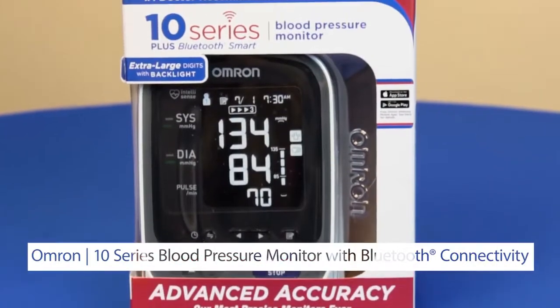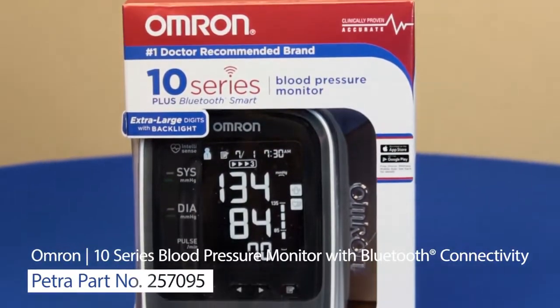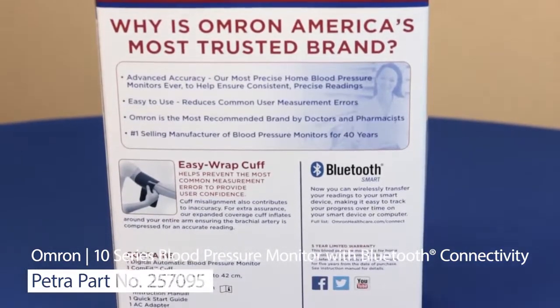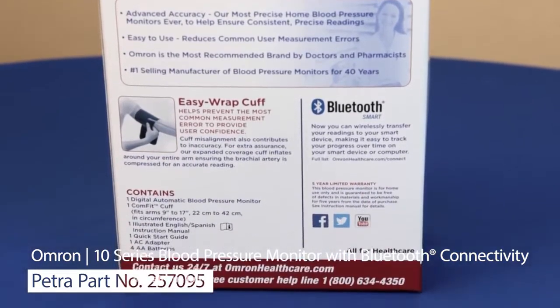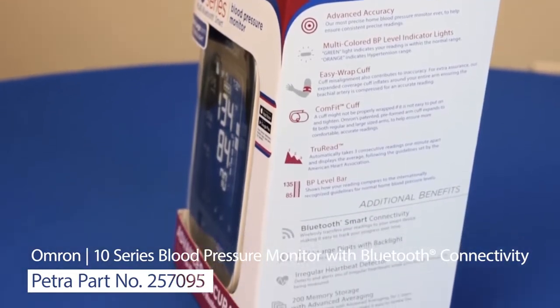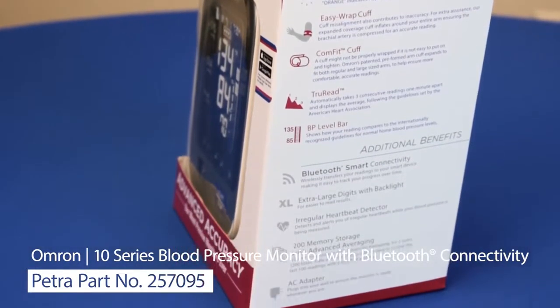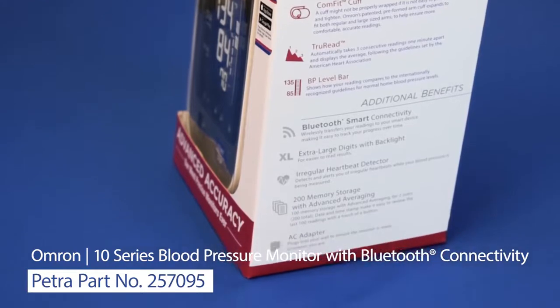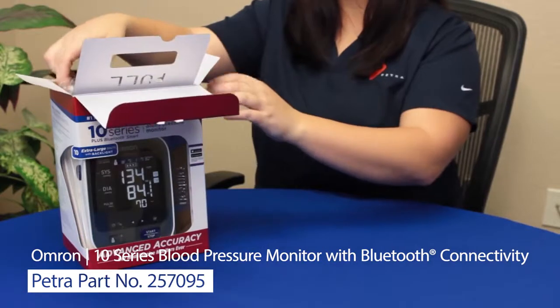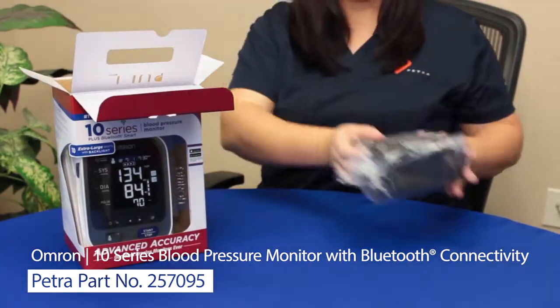This box is really designed to sell the product, with its large window and big type. Around on the back is additional information — again, it's easy to read — and the side has a complete list of features and benefits. The box itself has a cool slanted shape, so keep that in mind when you stock it on your shelves.